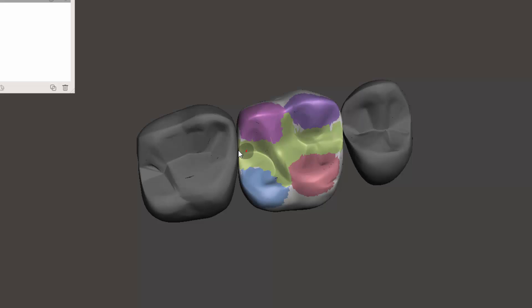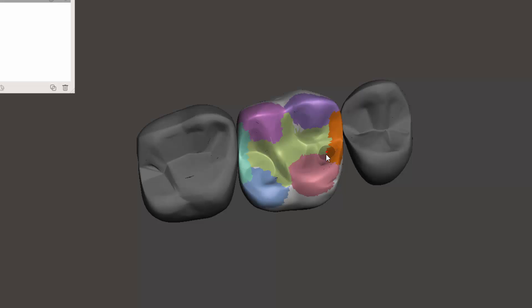One last thing you could do is you could come in right here, hit Control+G, and now we've got a marginal ridge. Select, and a marginal ridge again. Control+G.